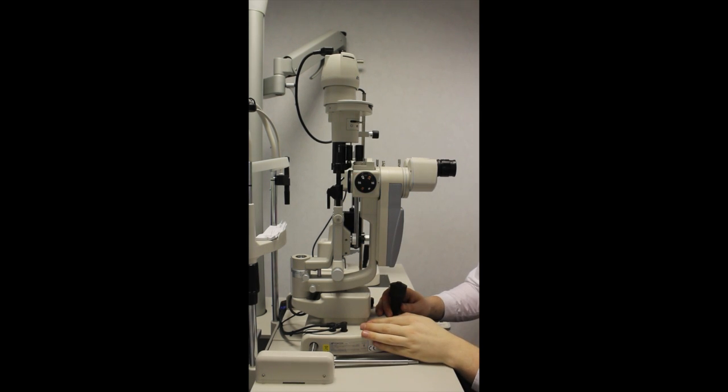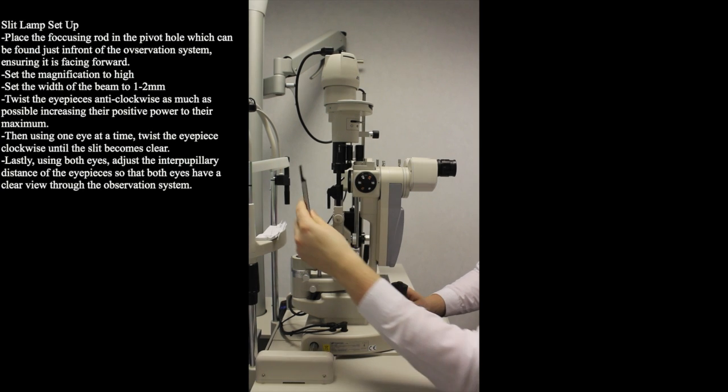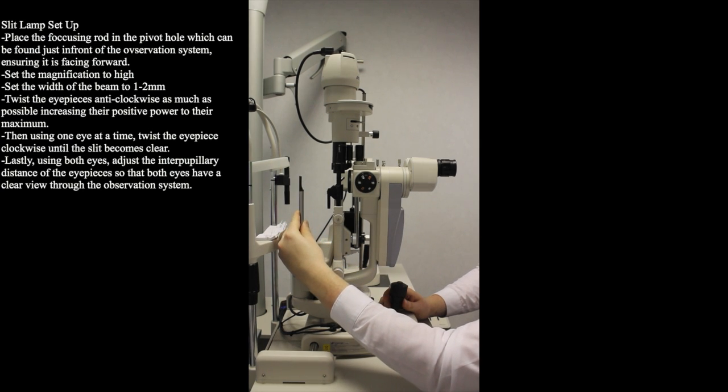It is essential to correctly focus the slit lamp before use to gain the most accurate and reliable view, especially when using high magnification. We do this using the focusing rod which is placed in the pivot hole which can be found just in front of the observation system.